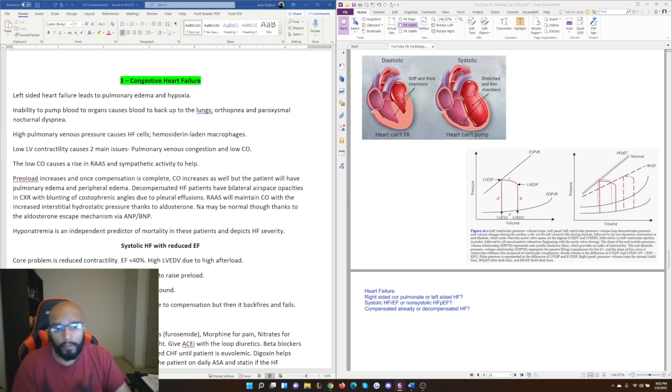How would you get this right? The question is just about right ventricular preload, left ventricular preload, and systemic vascular resistance. Of these three things, only the left ventricular preload will be low, while the right ventricular preload will be high and systemic vascular resistance will be high. Remember that 2, 3, aVF is mainly related to the right coronary artery, which means this is a right ventricular MI. This patient's severe pressure-like chest pain, along with the ST elevations in 2, 3, aVF, are a clear indication of inferior MI involving the right ventricle.